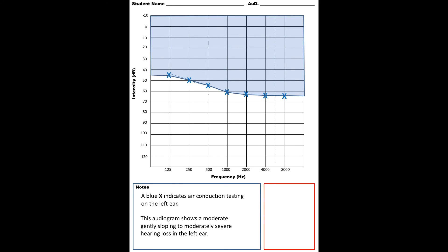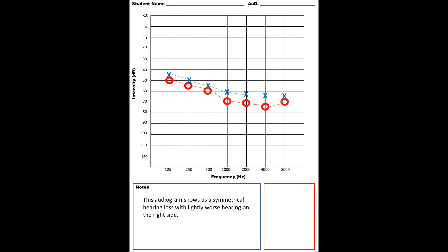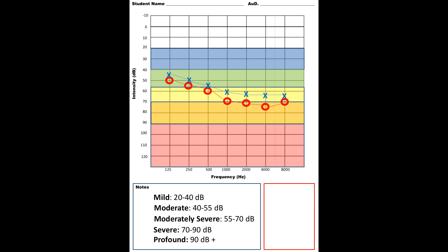When we show these together, you can see that the left and right ear are pretty symmetrical, but there is a slightly worse hearing loss on the right side. Here, if you want to see it against the background of the different degrees of hearing loss, you can tell a little bit better where it falls. When you're describing a hearing loss, it's important to be able to describe it in the terms of the degree. You can see that green shaded area, the moderate area, is where the hearing loss begins, goes down to severe in that right ear but only moderately severe on the left.